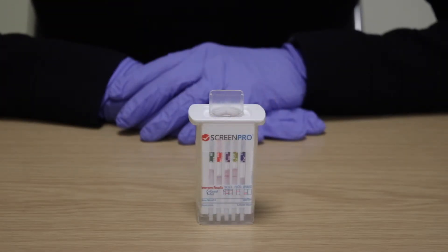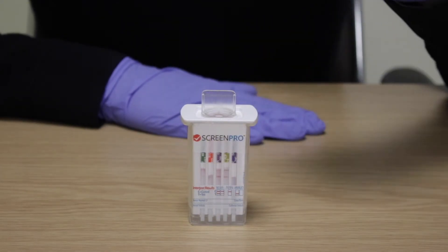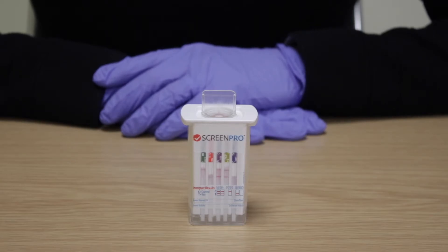Place the device on a flat surface and keep upright whilst the test is running. You can tap the device gently to remove any air bubbles from the base of the strips to ensure the device runs correctly. Note: the THC strip does not wick as quickly as the others. It is designed to wick slowly, allowing the sample and antibody to incubate, providing the sensitivity required to accurately measure THC.